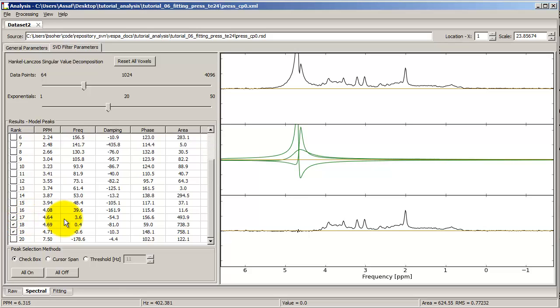and it looks like the SVD filter approximated the water peak using 3 Lorentzians. Looking at the bottom spectrum, which is the difference between the top and the middle, or the original and the selected SVD filters, we see that this filter has actually done a very good job of removing the water peak without visually substantially impacting the other peaks. So it works really well, assuming that you've selected the correct peaks and played around with the parameters for a bit.